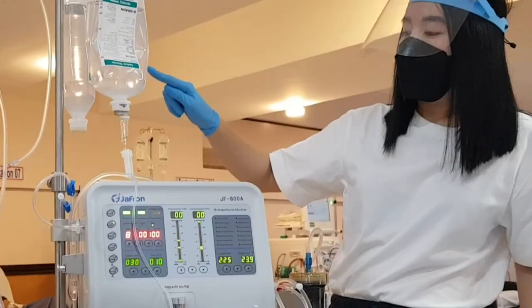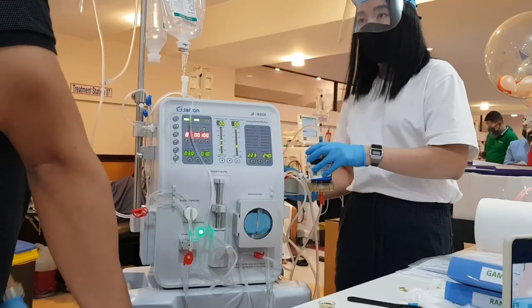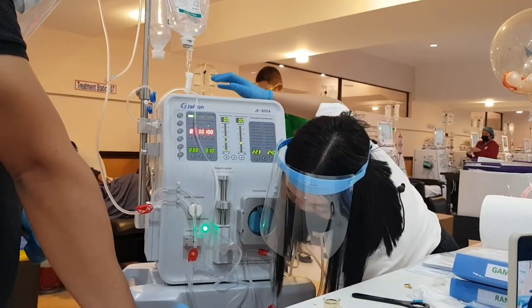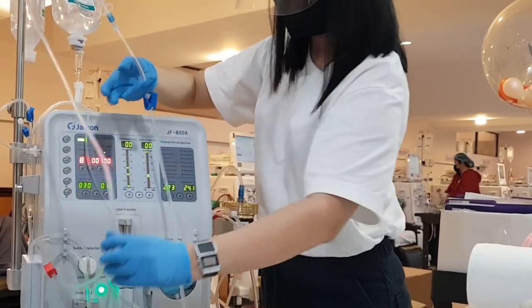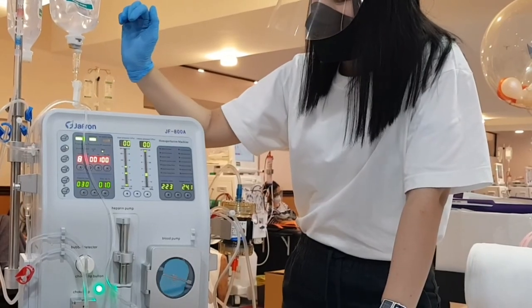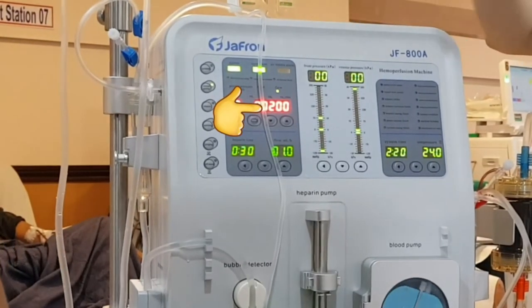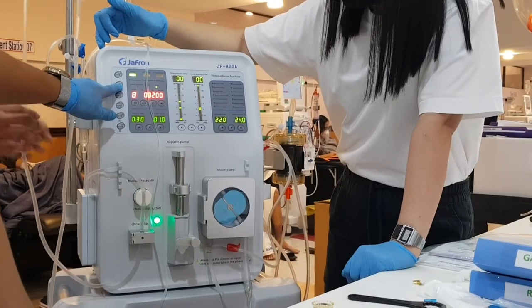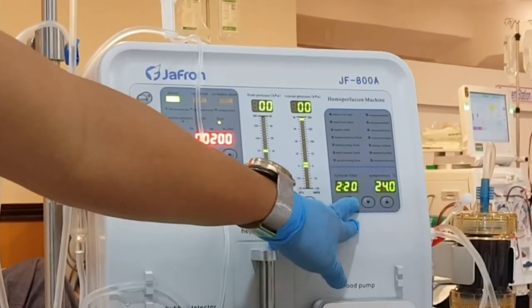Drain 700 ml of the heparinized PNSS. You can also try removing bubbles in this part by gently tapping the top header. Once 700 ml is drained, stop the blood pump. Put the lines back to recirculation mode by connecting again the venous and arterial patient's ends. Make sure the big red and blue clamps are open. Recirculate the remaining 300 ml heparinized PNSS for 25 minutes — BFR for the first 20 minutes should be 100 ml per minute, and for the last five minutes increase to 200 ml per minute to help remove air bubbles. Stop the blood pump, change the empty or remaining solution to plain NSS, set the system time, and you're good to go.